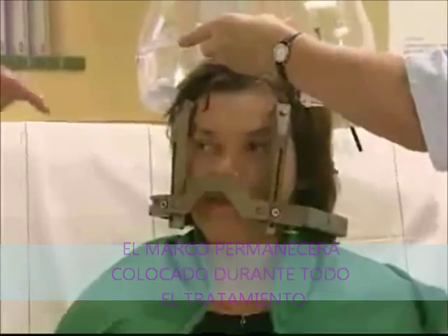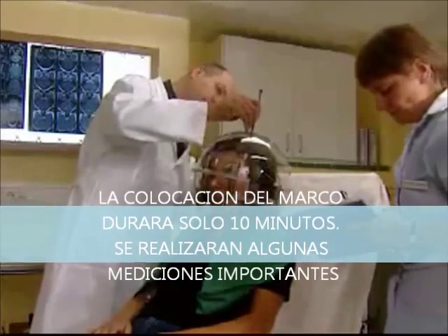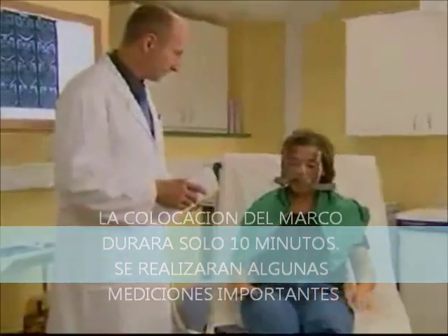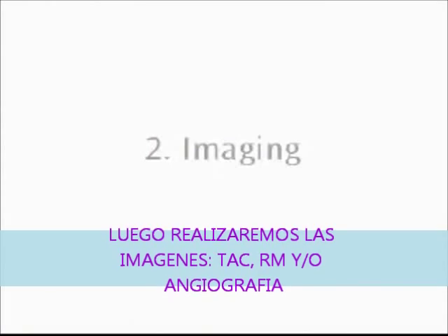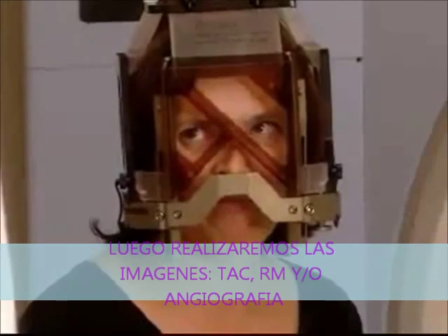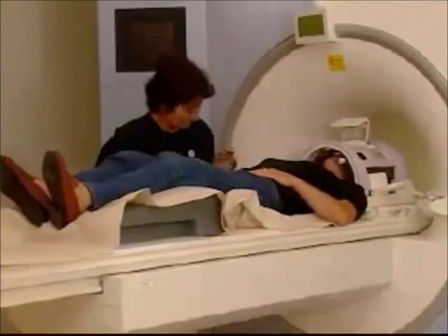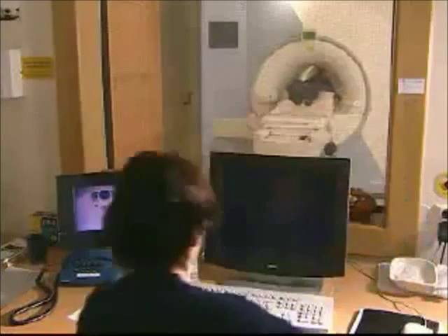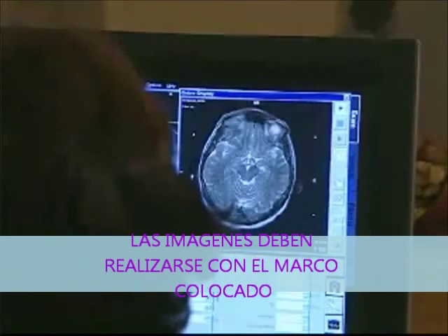A special device is used to define the position of your head in relation to the frame. After your head frame is in place, it's time for imaging — for example, MRI, CT, or angiography. A coordinate box is used during imaging to provide reference points on the images for the treatment plan. Although you may have done these imaging studies before, they need to be done again with the frame on to precisely define the location, size, and shape of the treatment area.